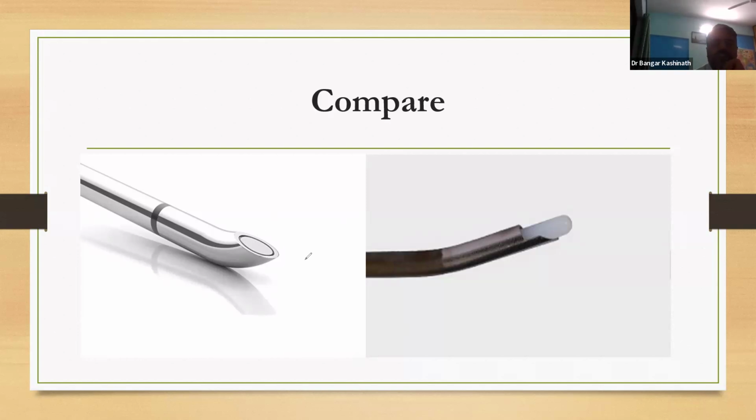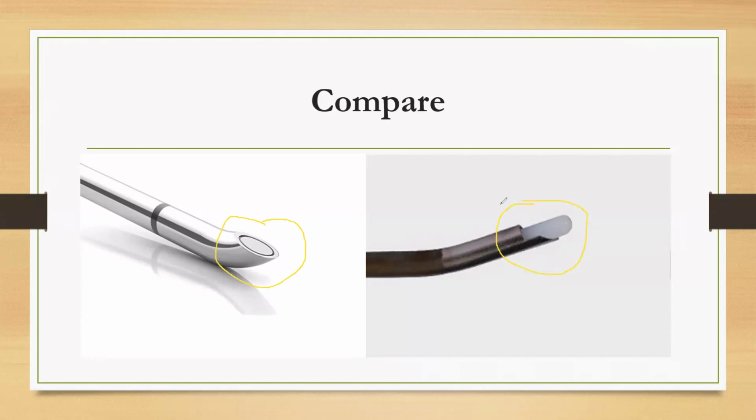Okay, see the difference at the tip. Okay? The difference is because here you can manipulate the catheter, and you don't have to take out the needle and catheter whole assembly. Do you understand? Yes, sir.